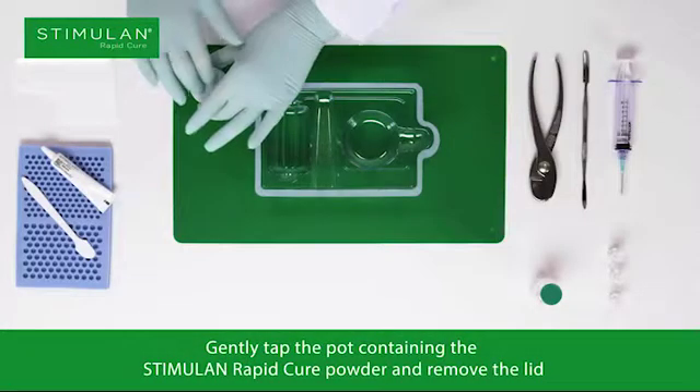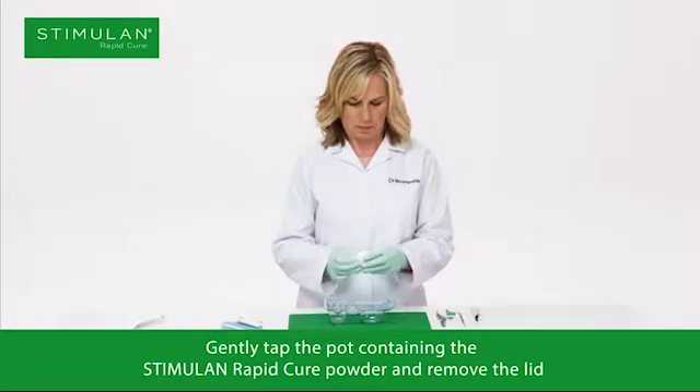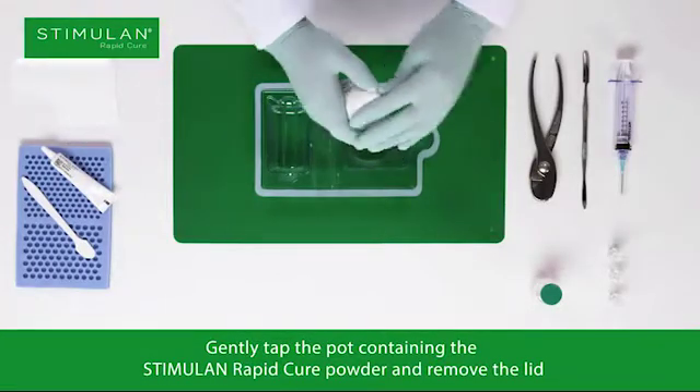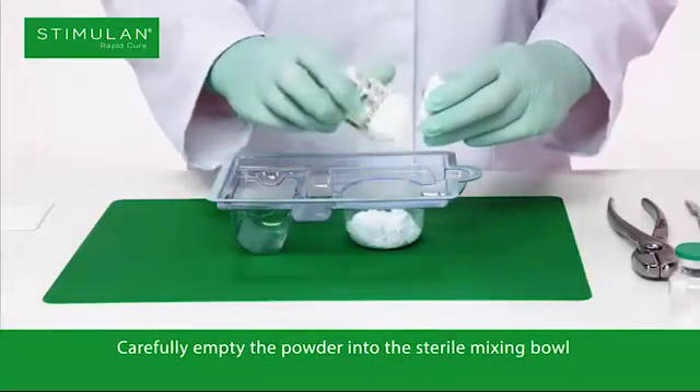Gently tap the pot containing the Stimulan Rapid Cure powder and remove the lid. Carefully empty the powder into the sterile mixing bowl.